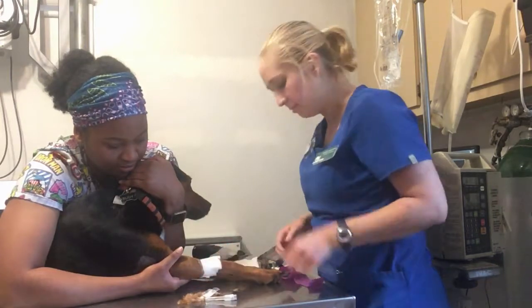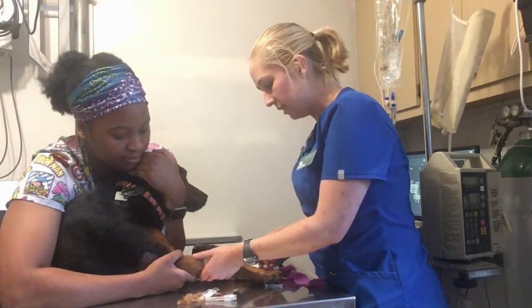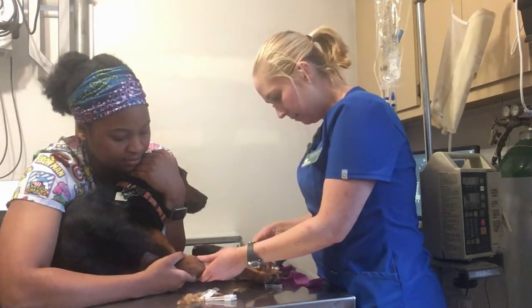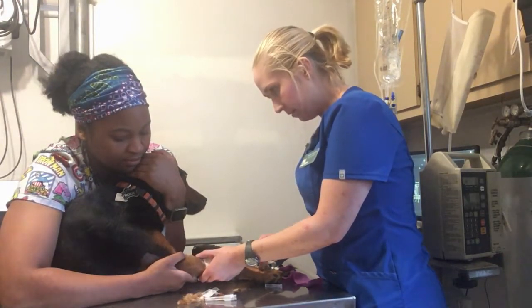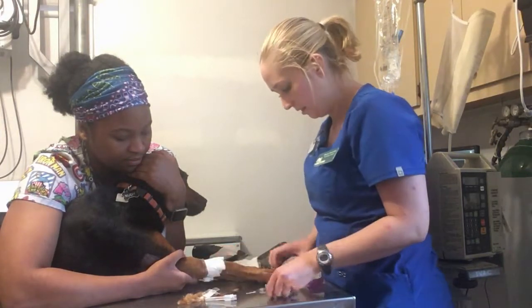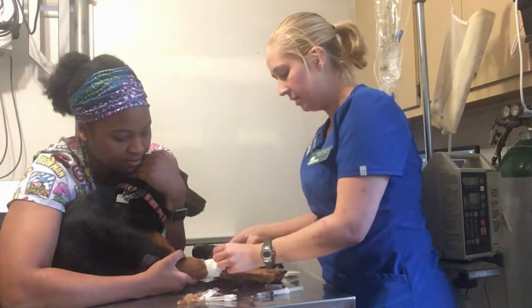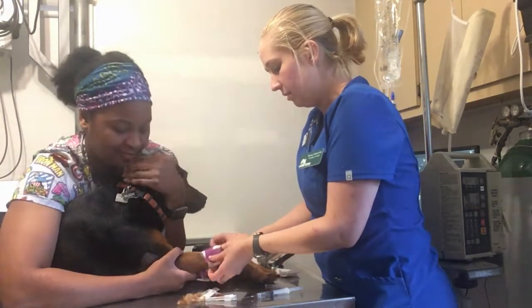Now that I have him taped, I'm going to go ahead and flush the catheter, make sure that we are still threaded through the vein. Then the last part you're going to do is take the vet wrap and do a final wrap.